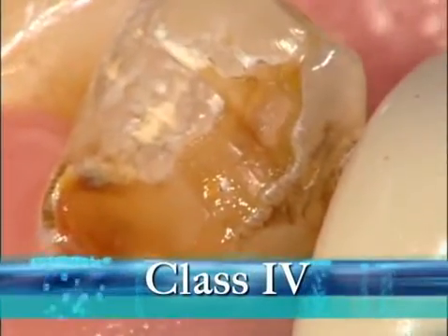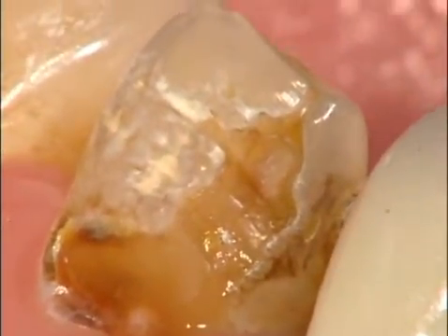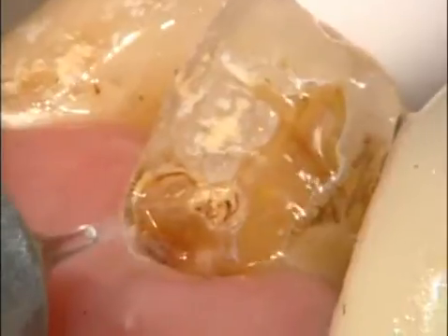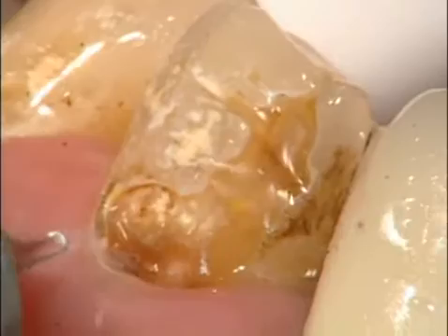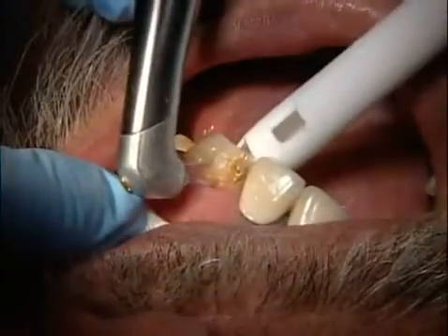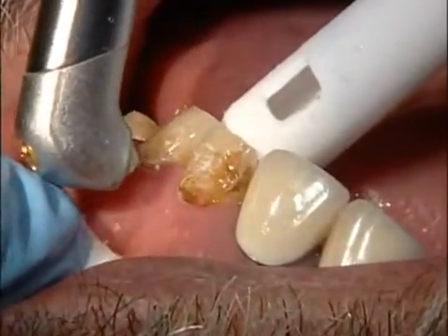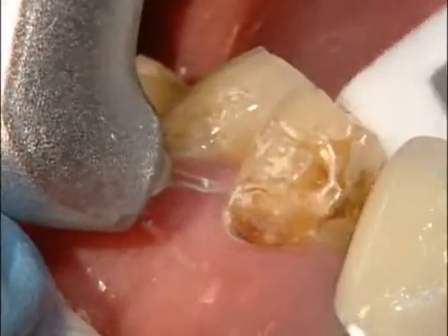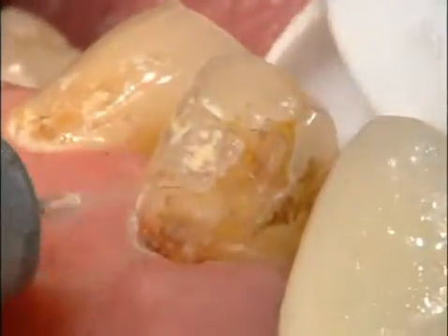So I'm going to do a class 4 on Dennis. Dennis had the misfortune of being in an automobile accident, hospitalized for 6 months, in a coma for 3 months. In that period of time, obviously had quite a bit of trouble with his teeth. So it's important for me to get his decay under control. You're going to also get to see him on a crown prep and eventually get his mouth restored to a condition that improves his appearance. First of all, we have to get his function back. So I'm going to do this.